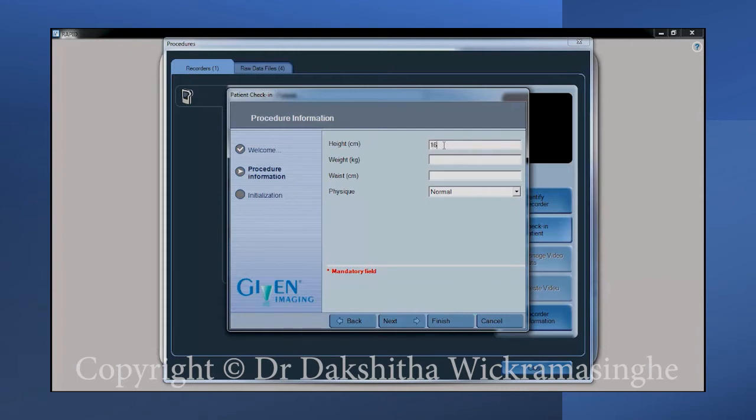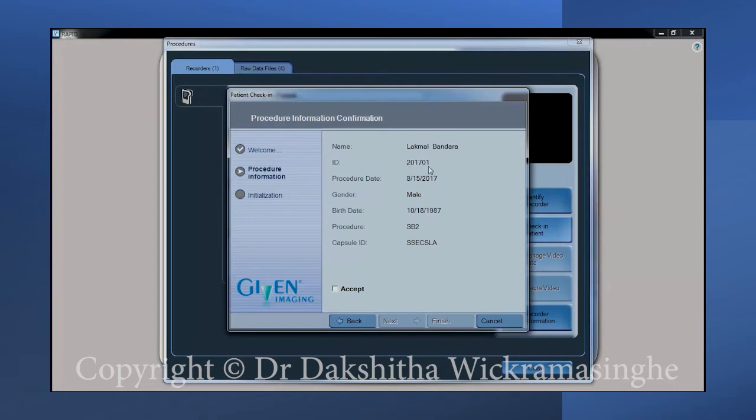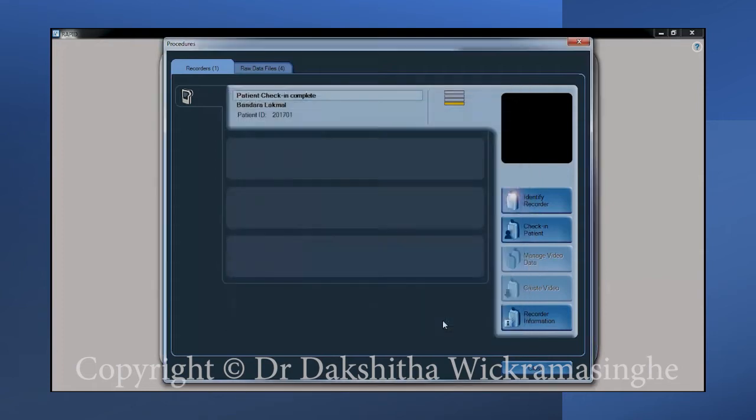Then enter the height and the weight of the patient. Click next to proceed. Double check all the information shown on the screen and click the finish button. This will transfer the data to the receiver and prepare it for recording. This will indicate that the patient check-in is complete.